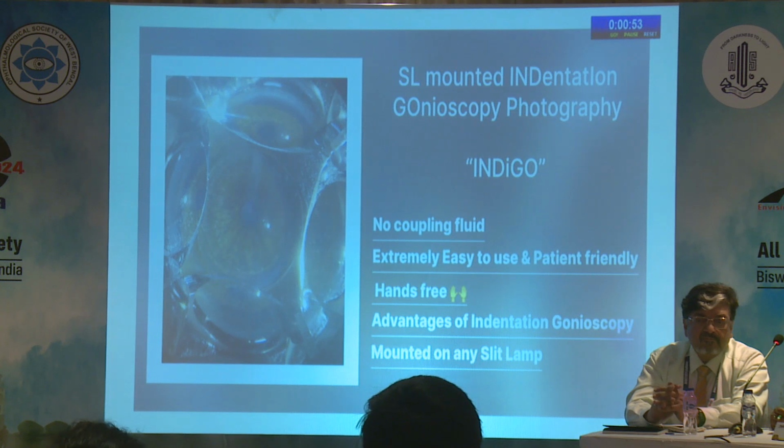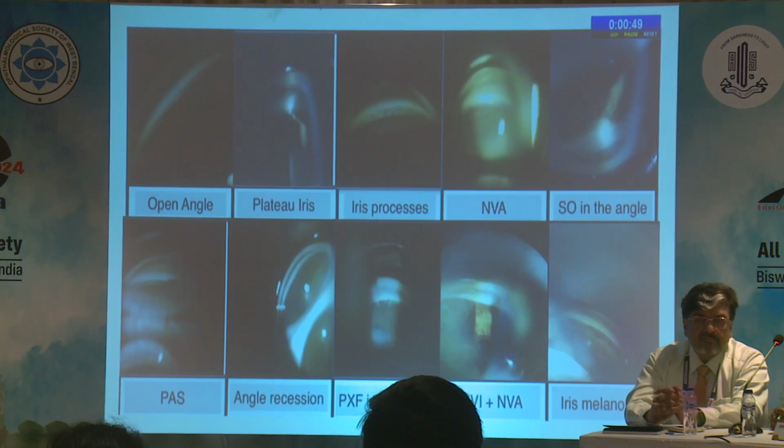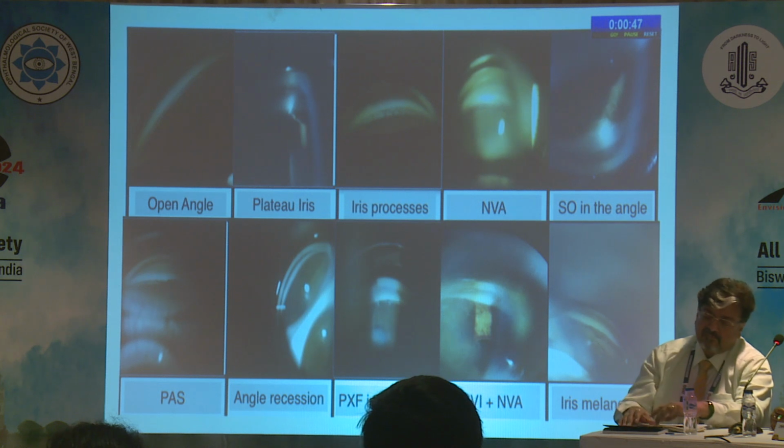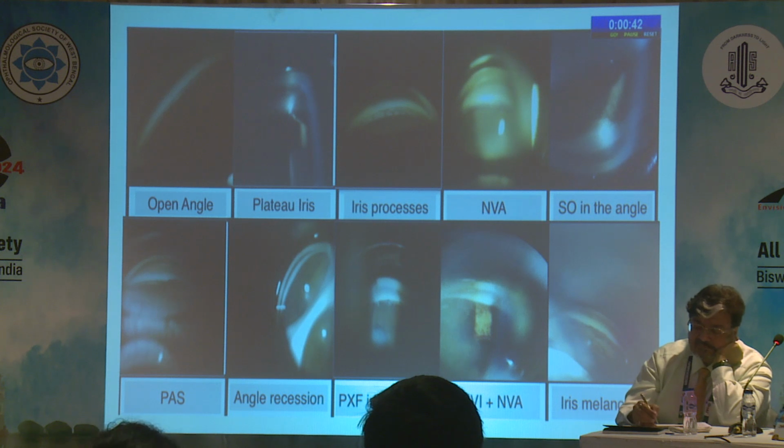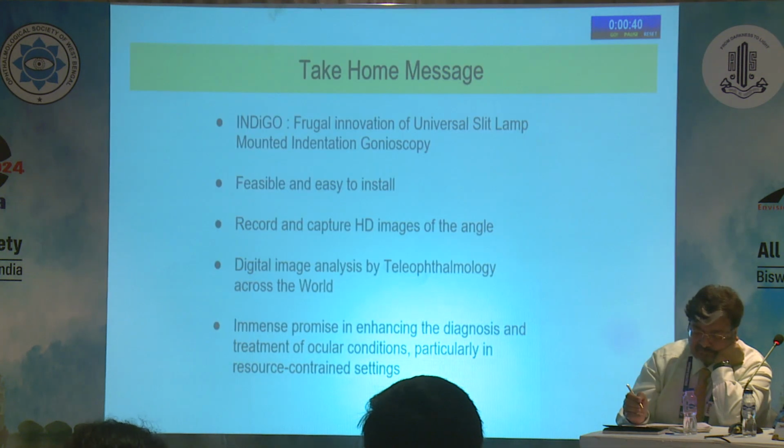Advantages of indentation gonioscopy: it can be mounted on any slit lamp. These are a few of my patients: plateau iris processes, neovascularization of angle, angle recession, pseudo-exfoliation of angle, iris melanoma, etc. Take-home message: Indigo, a frugal innovation of universal slit lamp mounted indentation gonioscopy.